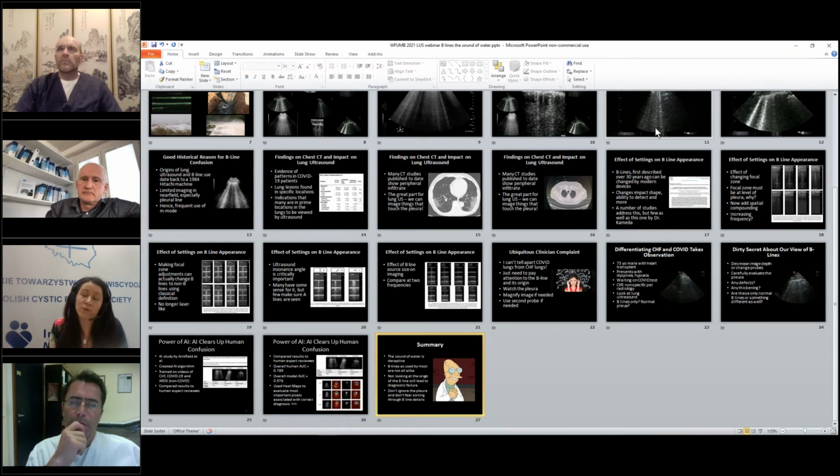And we work together for scientific purposes on CF children, and for those purposes we made an inter-observer study. So for this study we also assessed children in scores, but it was just for scientific purposes. If we want to assess them normally in everyday practice, we just use descriptives.